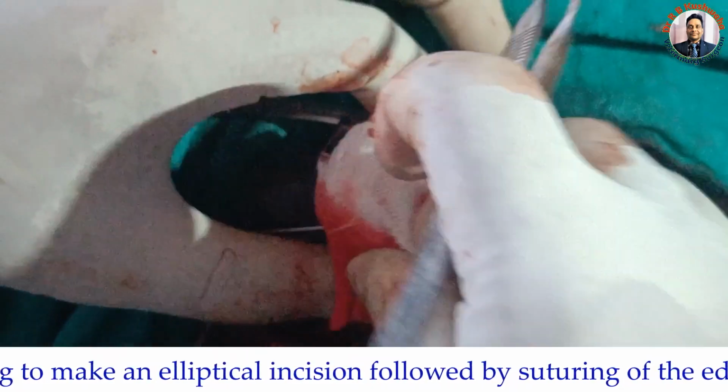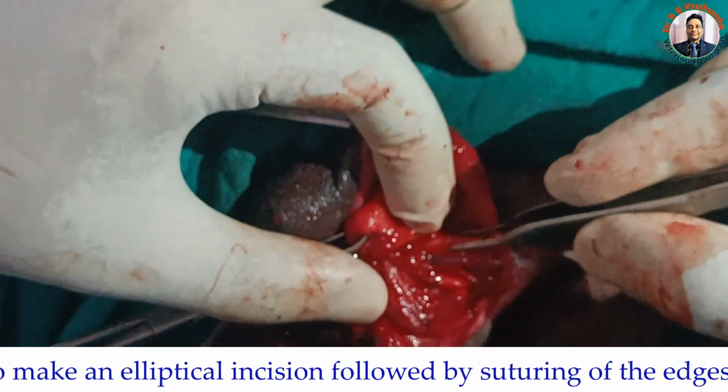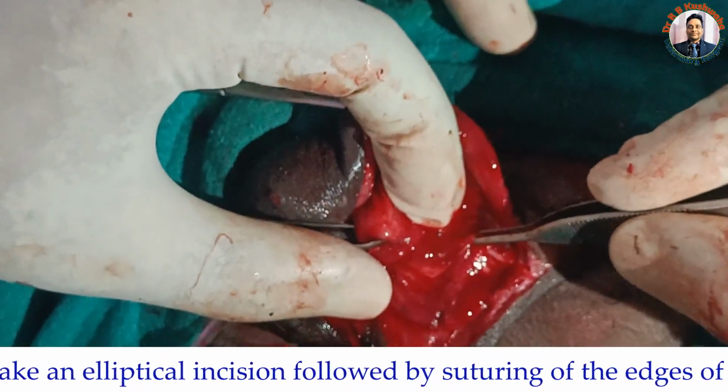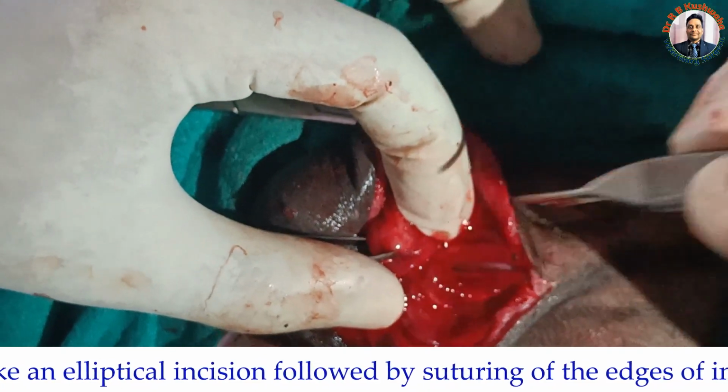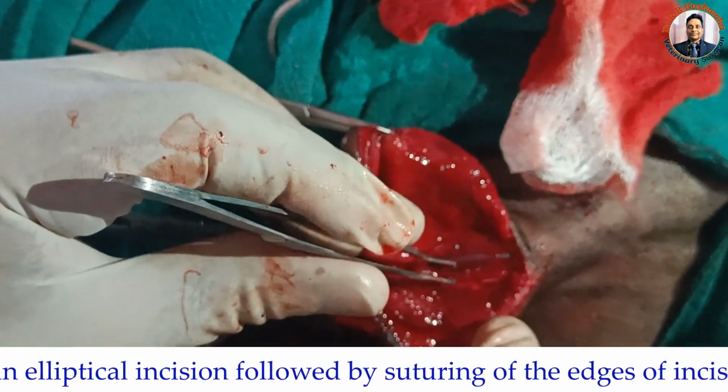So now what we do in the urethroplasty, we unite this mucosa with this mucosa to make the tunnel, the normal urethral opening.